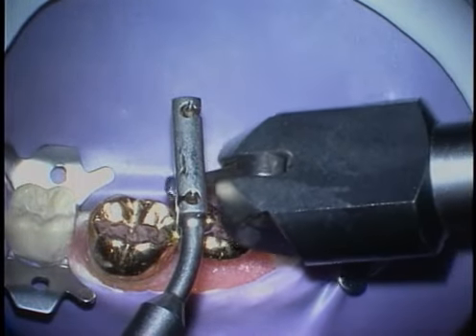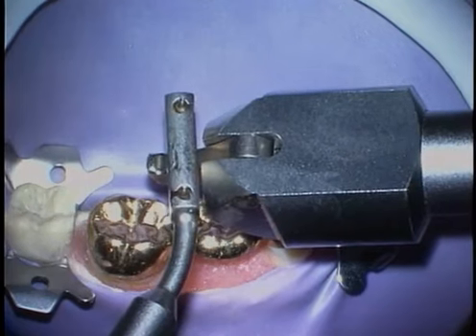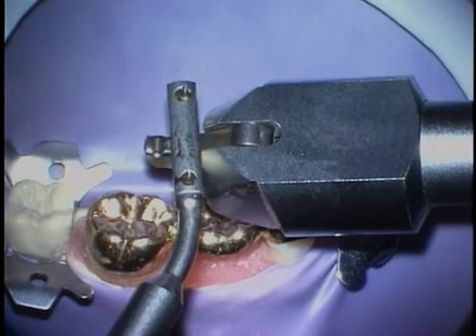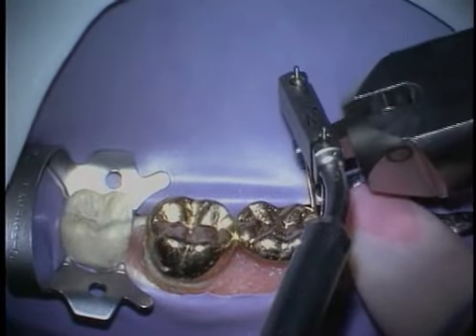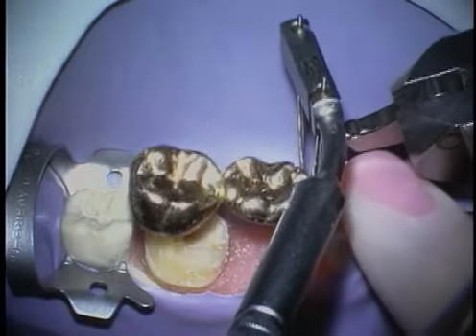Anticipating the path of removal is critical and allows for correct positioning of the hammer against the loop holder in preparation for trigger activation. Four to five pulses of air are delivered before moving the loop anteriorly and repeating the process. Crowns and bridges retained with zinc phosphate cement are the easiest to remove. With experience, bonded restoratives can also be removed.